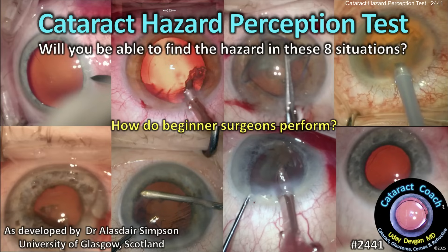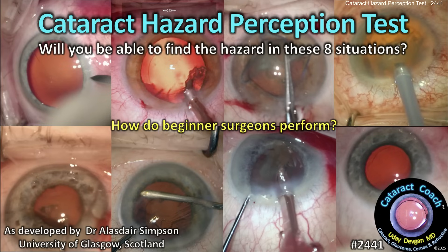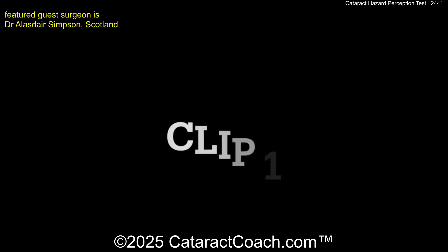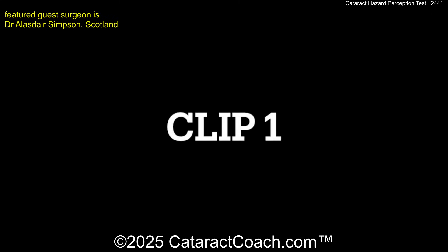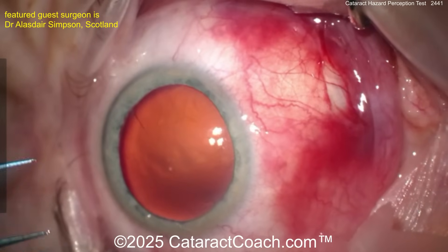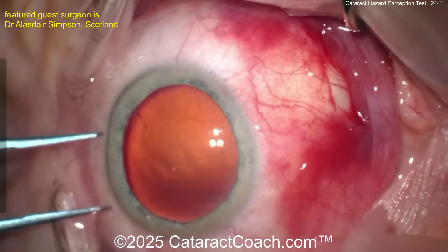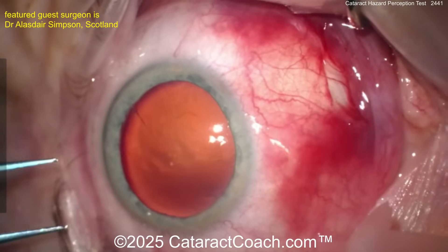Cataractcoach.com. The cataract hazard perception test — will you be able to find the hazard in these eight situations? This is a really fun one. Check this out. Here's clip one. The question is: what's going on here? What is the issue? Let's look — what do you think?